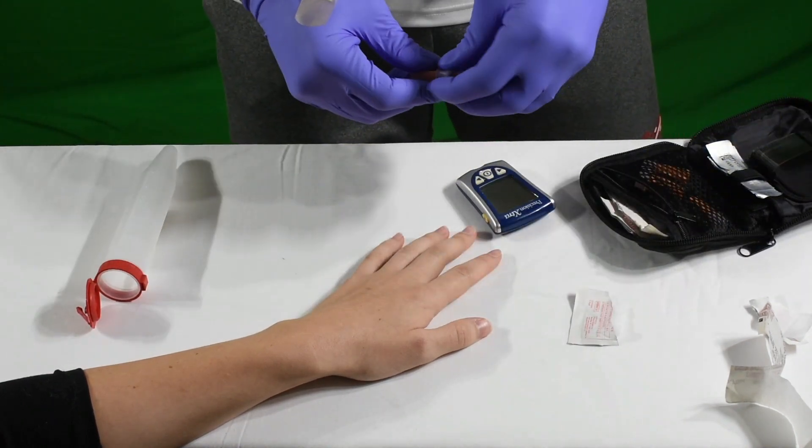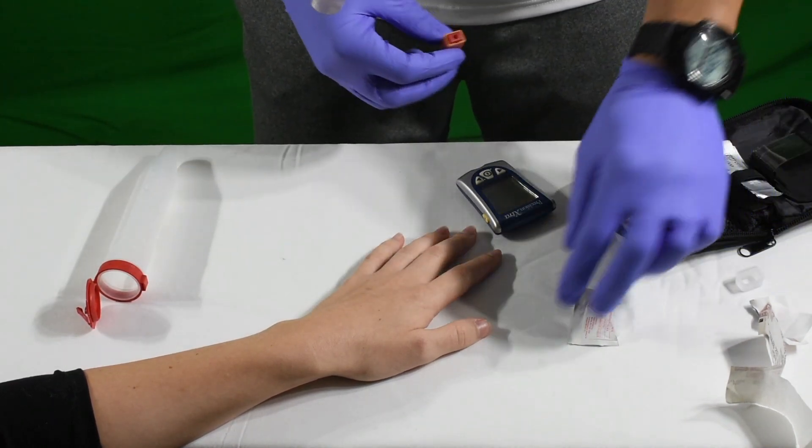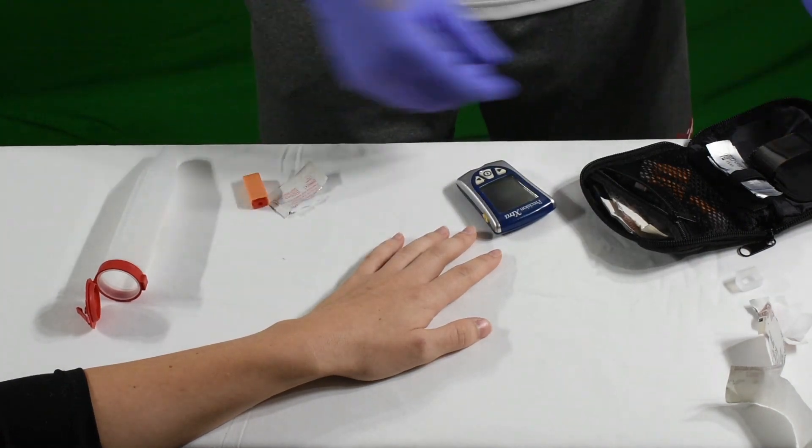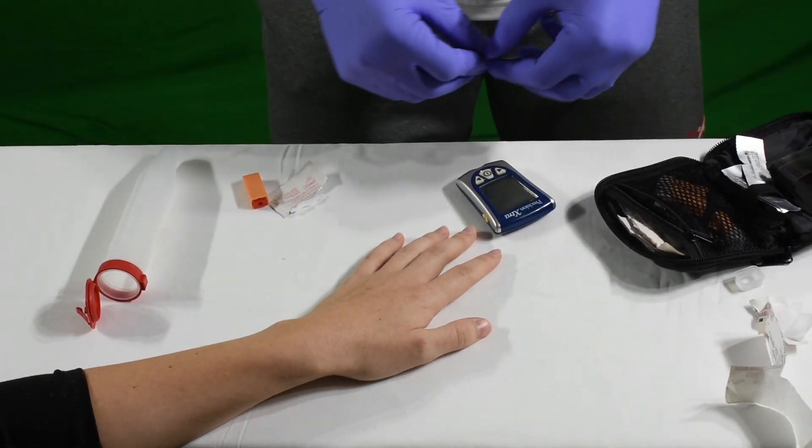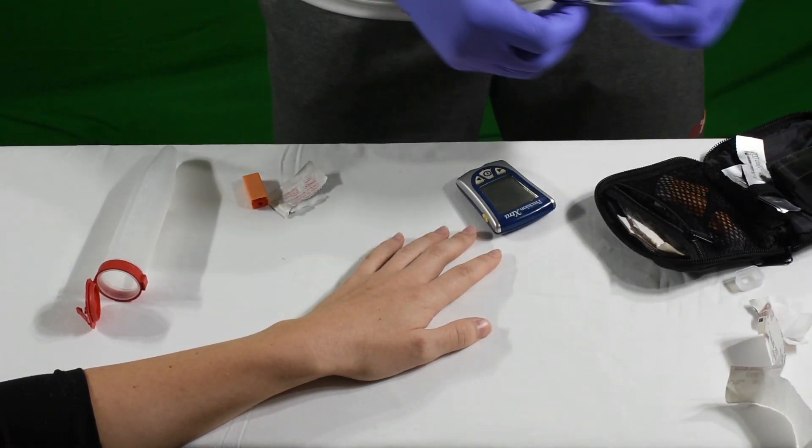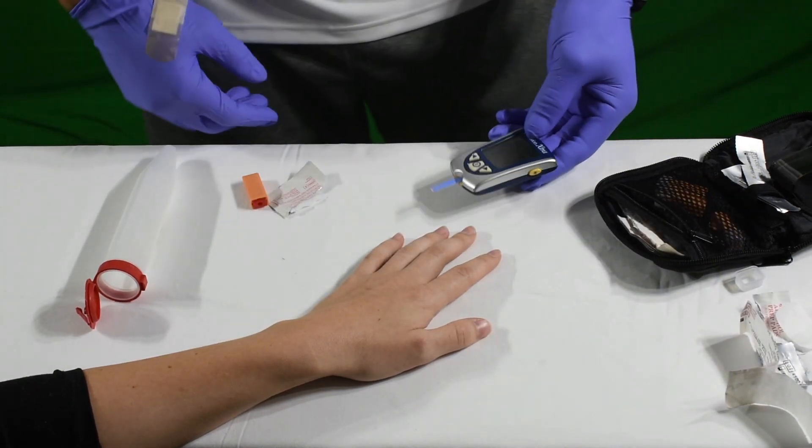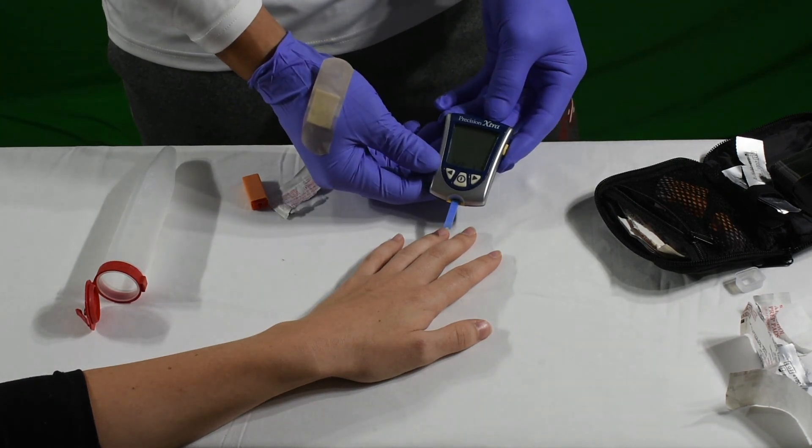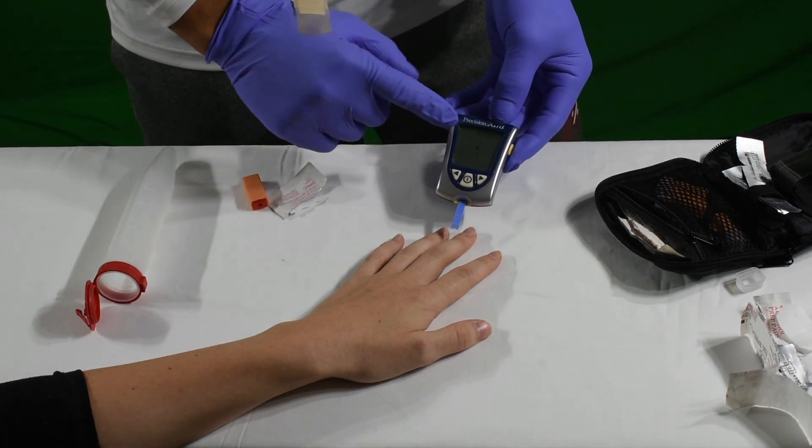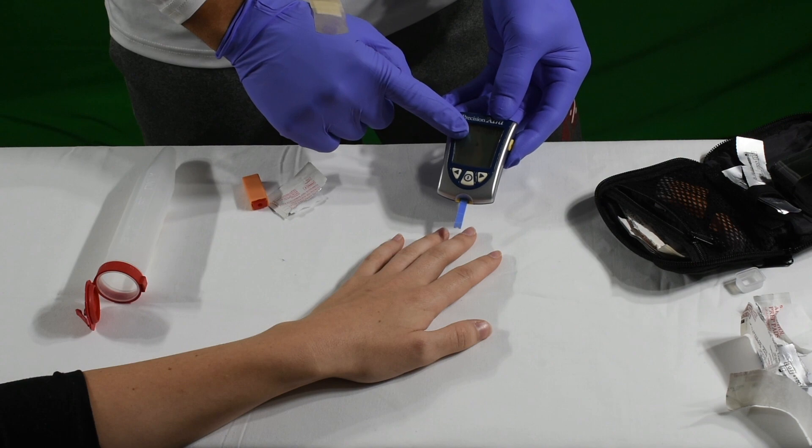There are all different types of lancets out there that you may see. This one you just pop off and apply pressure. You're going to put the test strip in the monitor, the glucometer. Wait for it to load up. It will let you know when it's ready when you see a little blood drop.